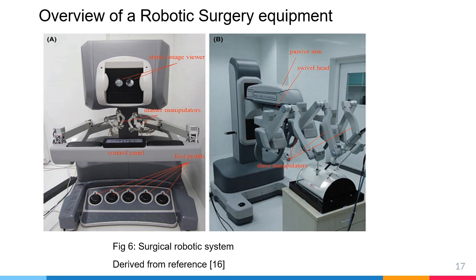The Da Vinci system is a remarkable improvement over conventional laparoscopy, in which the surgeon operates while standing and uses handheld, long-shafted instruments that cannot bend or rotate. With conventional laparoscopy, the surgeon must look up and away from the instruments to a nearby 2D video monitor to see an image of the target anatomy. The surgeon must also rely on his patient side assistant to position the camera correctly.